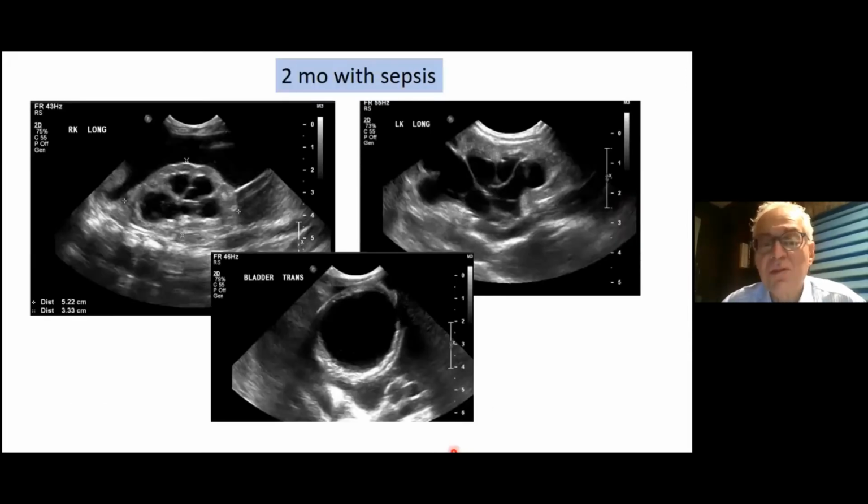This is interesting. This is the ultrasound. So you can see the right kidney here with the ascites surrounding the right kidney. You can see the left kidney here, both have significant hydro, and you see this very distended, abnormal, thickened bladder in the pelvis. So this was indeed, we thought, a case of urethral valve.